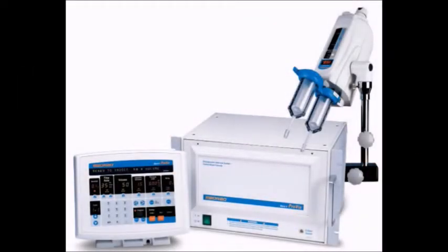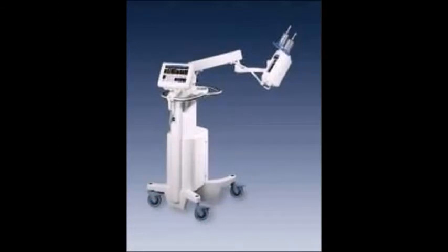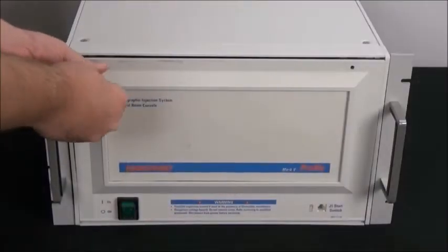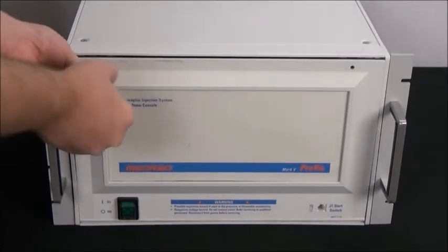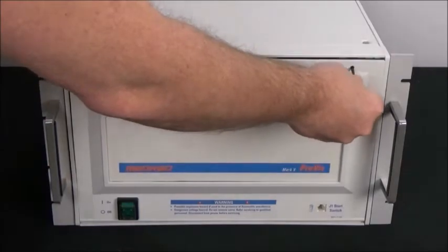These voltages are measured in the main unit. There are two types of main units, rack mount and all-in-one pedestal. Whichever one you have will determine how you get to the boards. For a rack mount system, loosen the two Allen screws at the upper left and right corners of the main unit, then lower the door to access the boards.